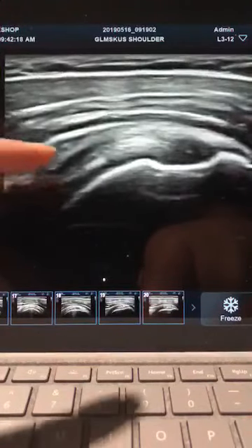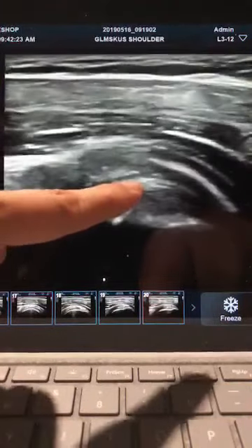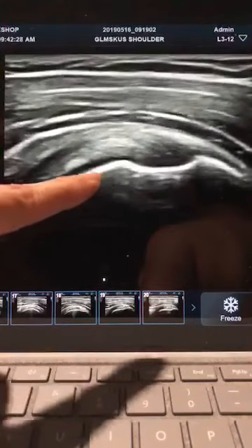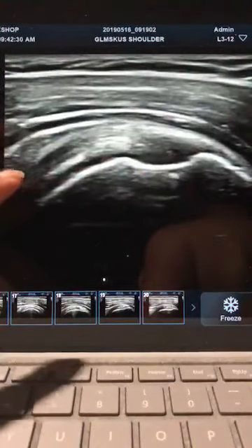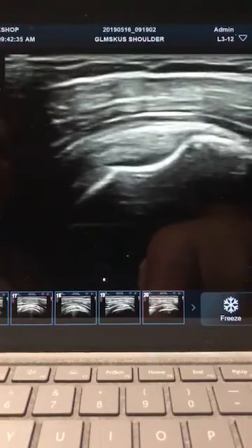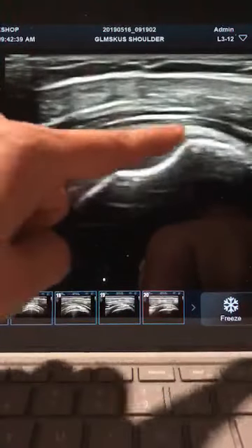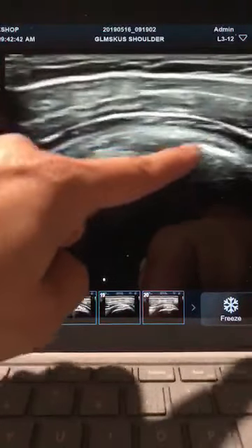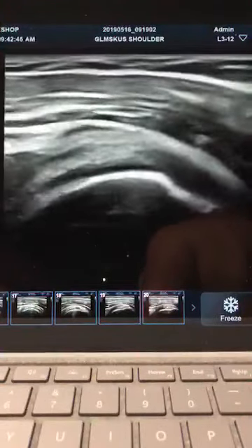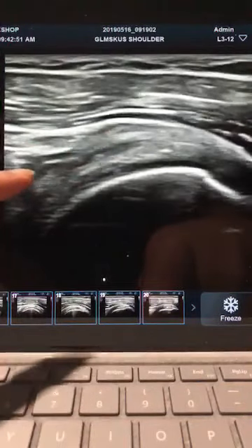If I have a hard time identifying which plane I turned into, then I always scan medially to the biceps tendon, tilt and move the probe laterally and scan lateral, and this first slice, and it's a subtle movement, is the anterior segment. If you toe-heel the transducer or heel-toe the transducer, this is a heel-toe maneuver, it'll allow you to see the fibers at the level of the anatomical neck, and you can eliminate the anisotropy. If you toe-heel the transducer, it allows you to see the musculotendinous junction here.